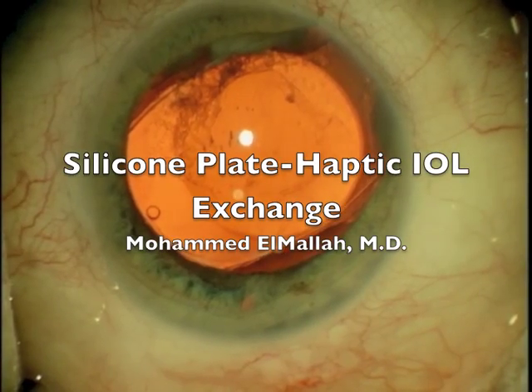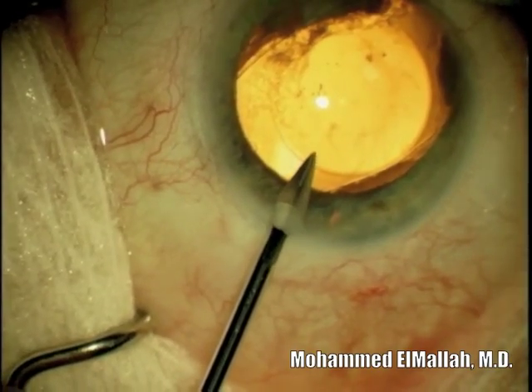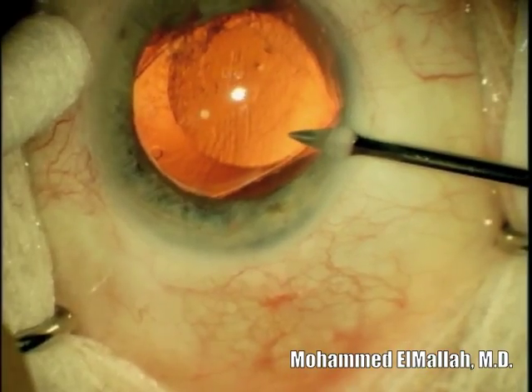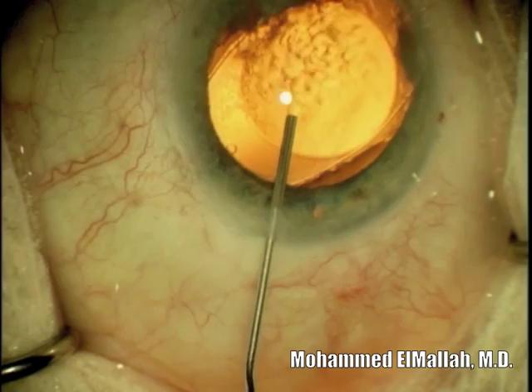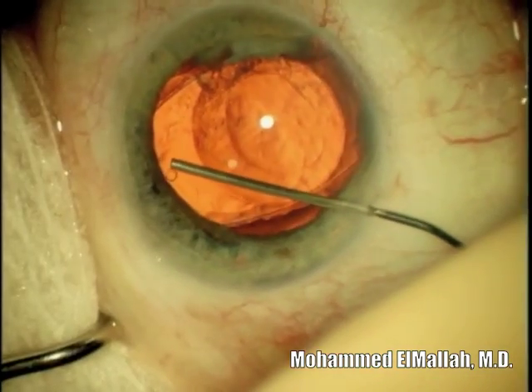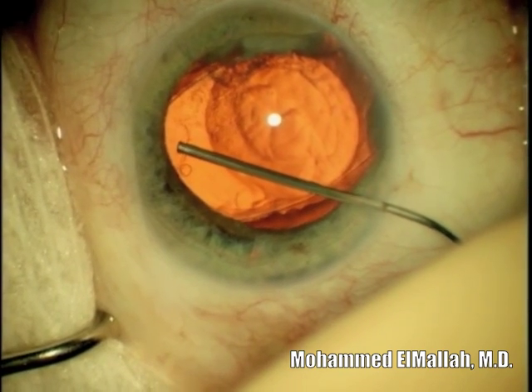This is a case of a silicone plate haptic intraocular lens exchange. The patient had had cataract surgery 9 years prior and had noted an irregular pupil ever since surgery. When I saw her in consultation, I noted that the superior haptic was in the capsular bag, but the inferior haptic was in the anterior chamber angle.